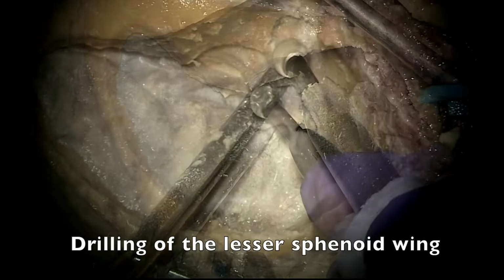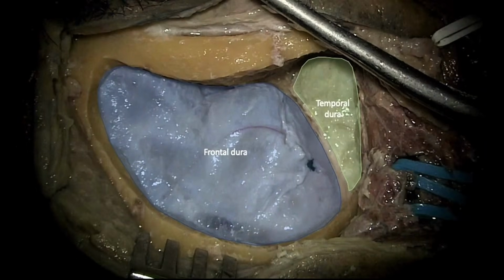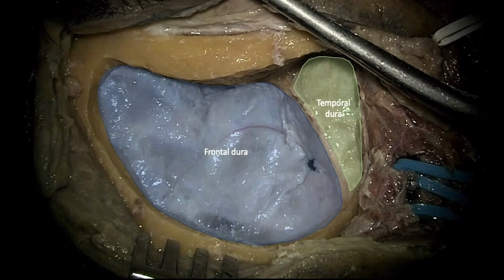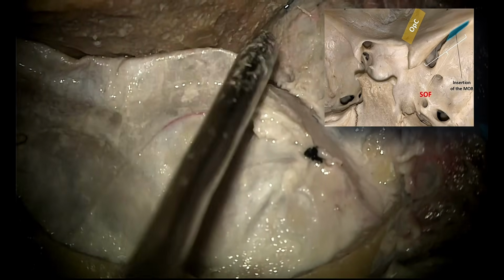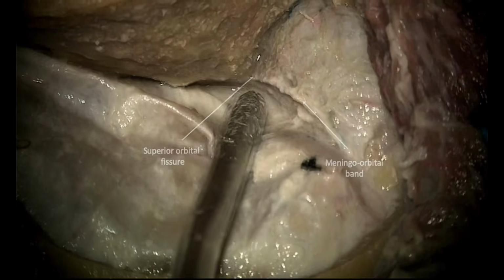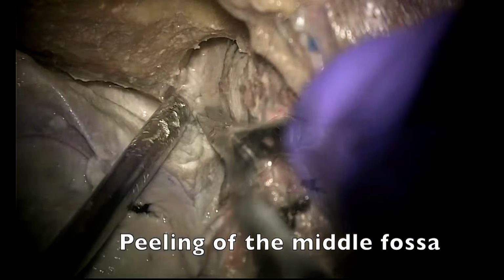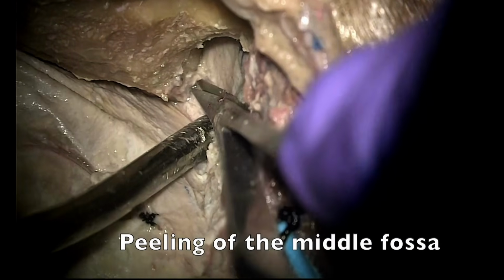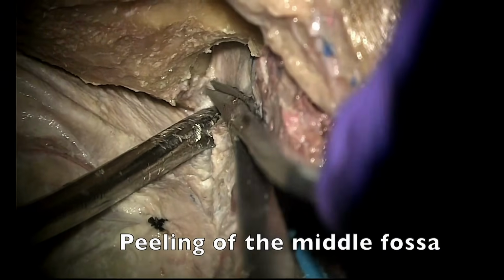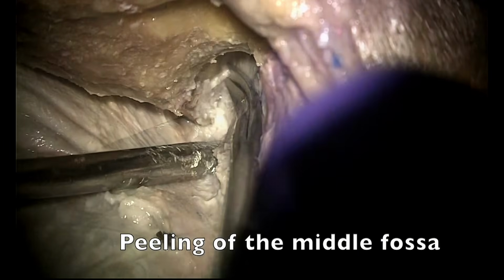Supraorbital craniotomy is performed. Once at this point, we drill the sphenoid ridge flat with the superior orbital fissure, and it's at this level of the superior orbital fissure where we find this tent that is called the meningo-orbital band. This structure needs to be coagulated and divided, allowing for the incision of the outer dural layer and entry into the interdural space along the lateral wall of the cavernous sinus. This is called the interdural plane.